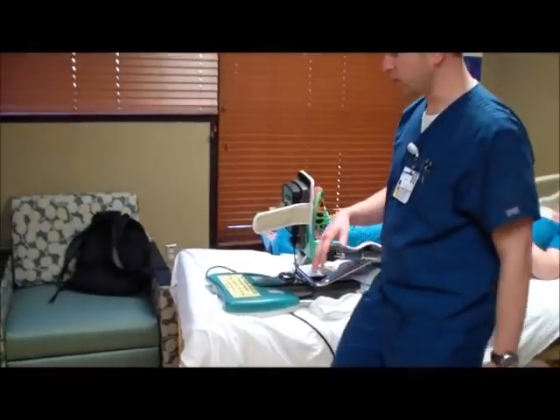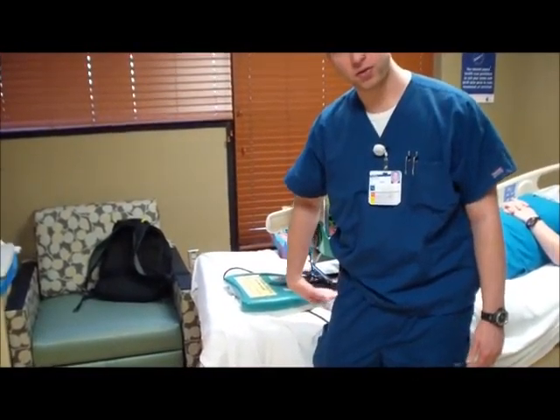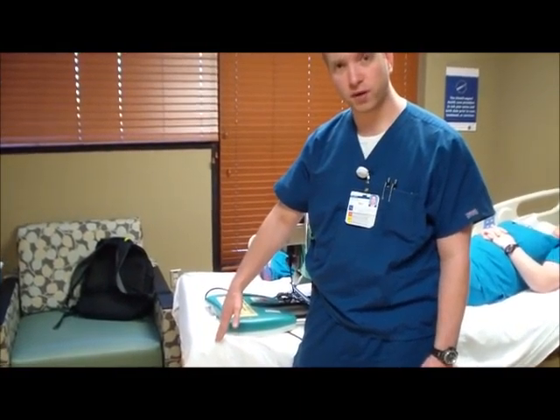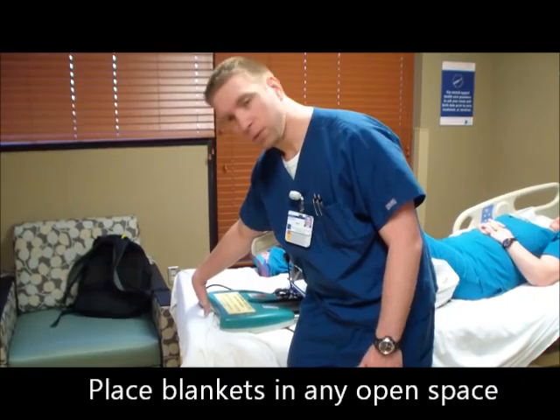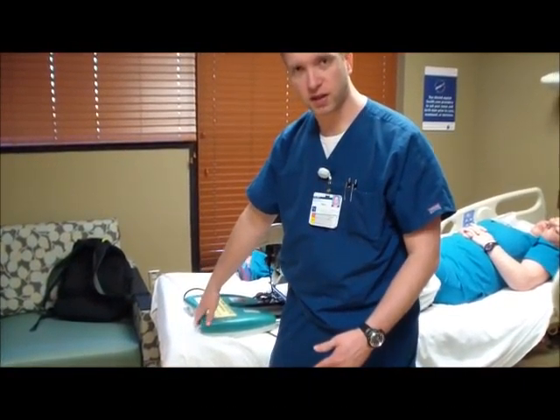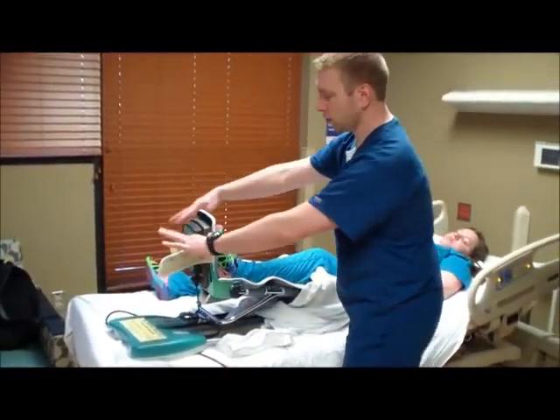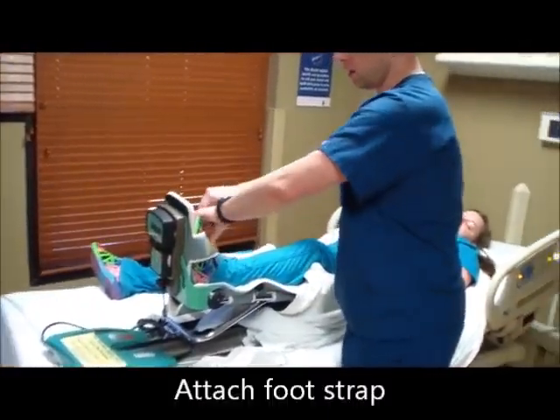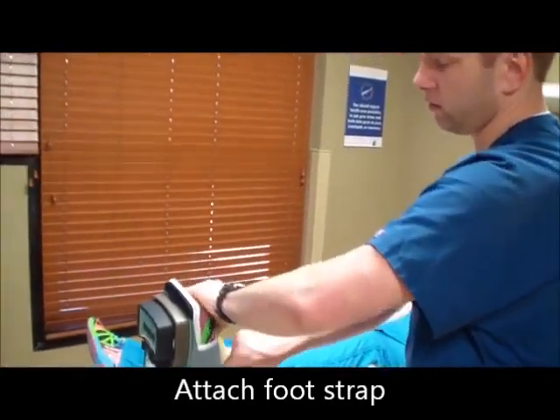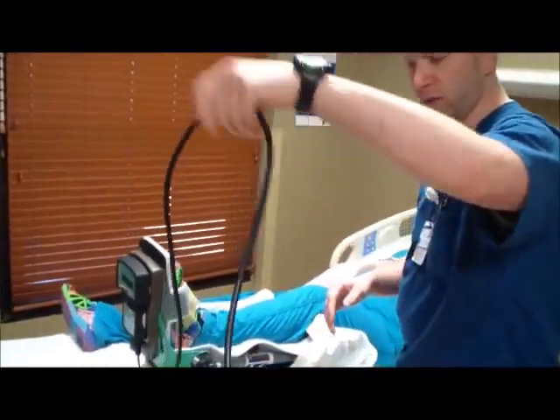And also, if you're having difficulty, if you've already gone up as high as you can go with the baseboard and you still have room left over, what you can do is take some thicker blankets, place them between here and the baseboard, and then bring it up as high as you can, making sure that that's keeping the CPM in place. So we're going to bring our Velcro around her foot, keep that in place. We also have our cord as well.